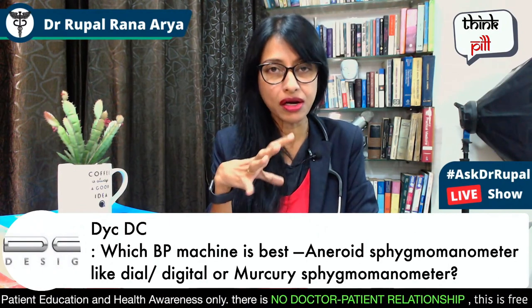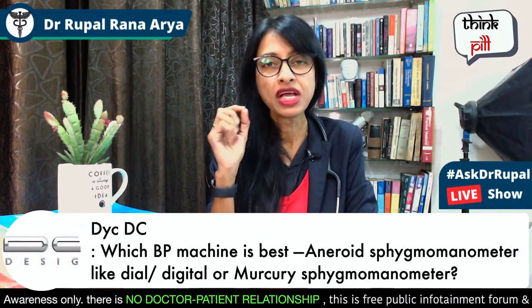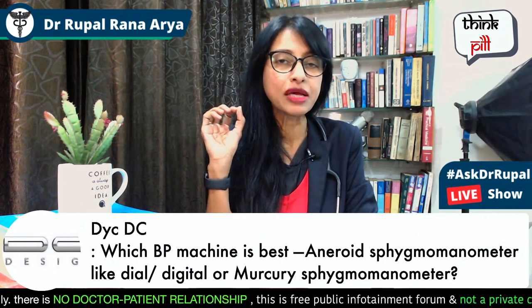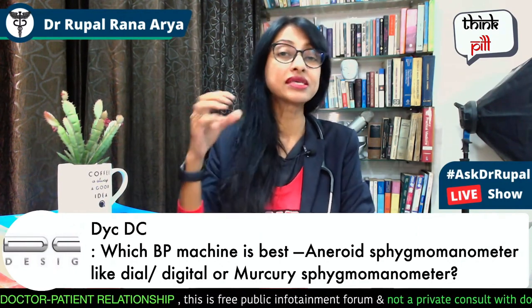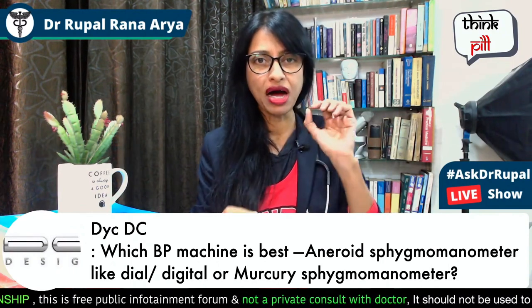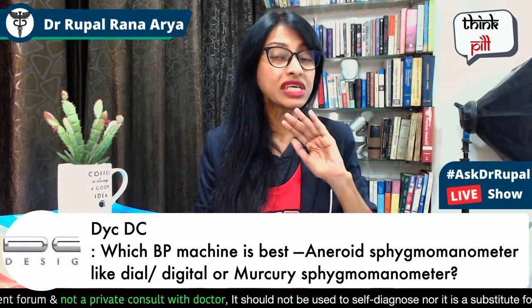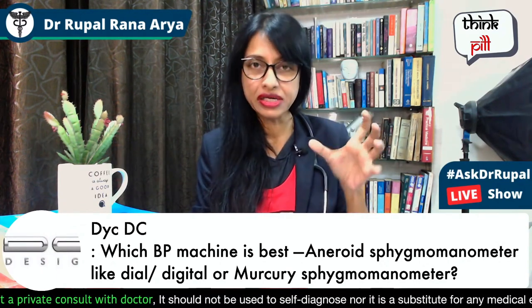Secondly, the digital BP monitors available in the market have many features. Not just blood pressure, but the pulse is also measured. Also, if your blood pressure is increased or reduced, it can beep on the monitor. And if your heartbeat is irregular, that can also be indicated.